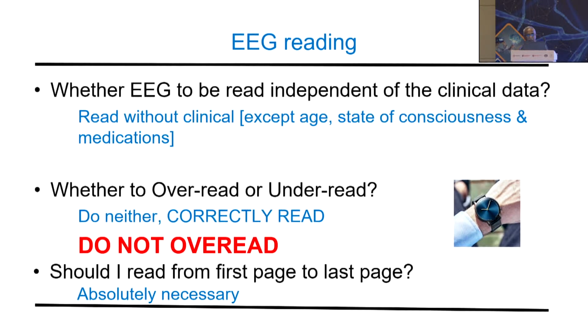So if you have to go for your lunch or to see the patient or you have been called to the OPD, don't start reading the EEG within the next 5 to 10 minutes. Better to leave that and then come back at a time when you have got the time to read the EEG. The second thing that is recommended is that when you read the EEG, you have to be at least about a hand distance, 1.5 feet away from the screen, and you should be faced at the middle of the screen.